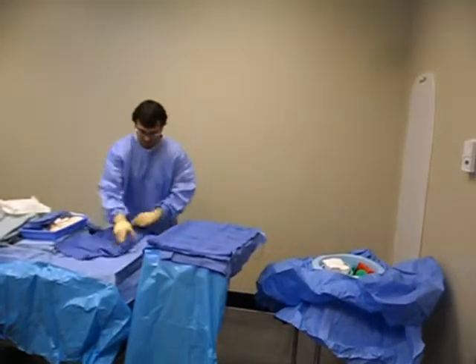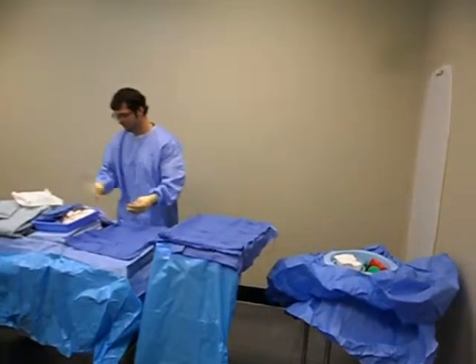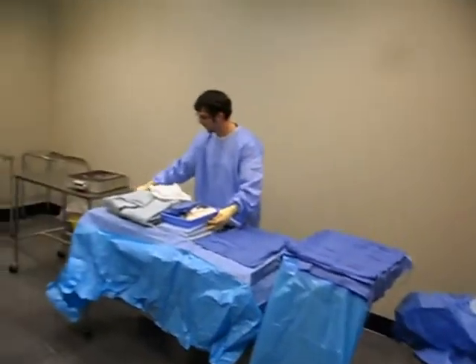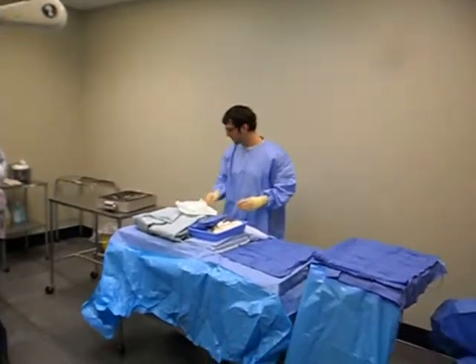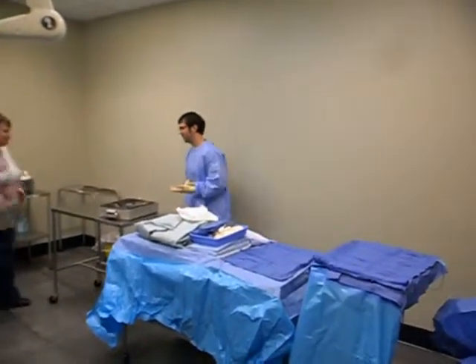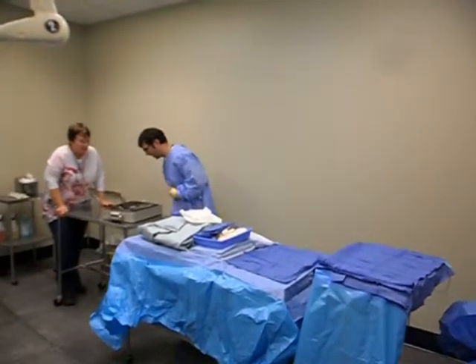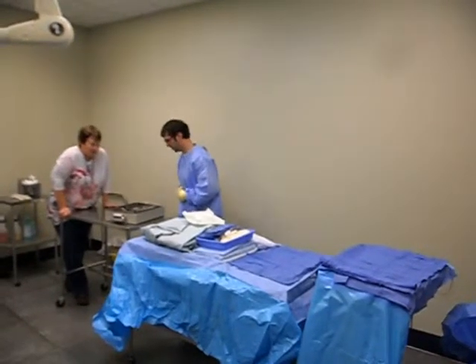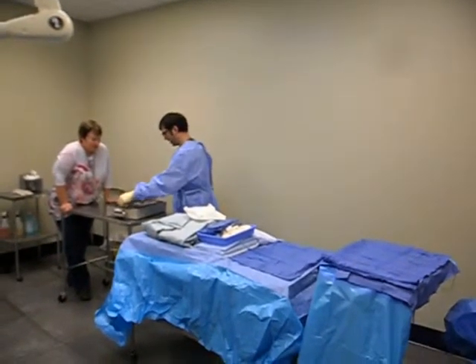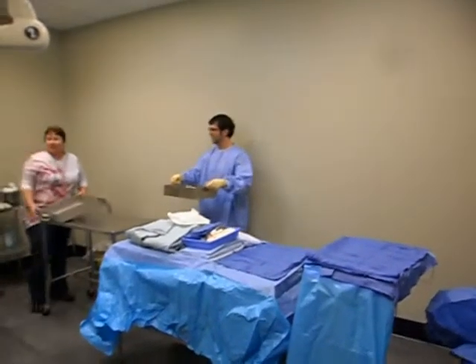So, I'm just going to make myself a little room. Nothing's hanging or touching anything like that. Discard that. I'm going to come over here. The filter on the top changed? Yep, and the indicators on the outside were changed. Okay, and that's upside down, I can't see it, but it looks good. Okay, I'm going to grab this. How's that filter doing? I'll check this filter, looks good.